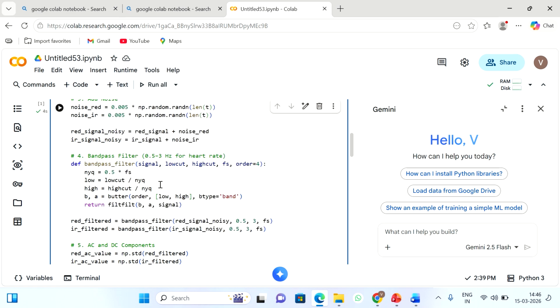Order, we are always taking 4, and then low, high. So the low value is determined here, and the high value is determined here. Then the Butterworth type of filter is equal to band pass filter. We are considering a band pass filter. And then, after filtering, it will return the coefficients: numerator coefficient B and denominator filter coefficient A.